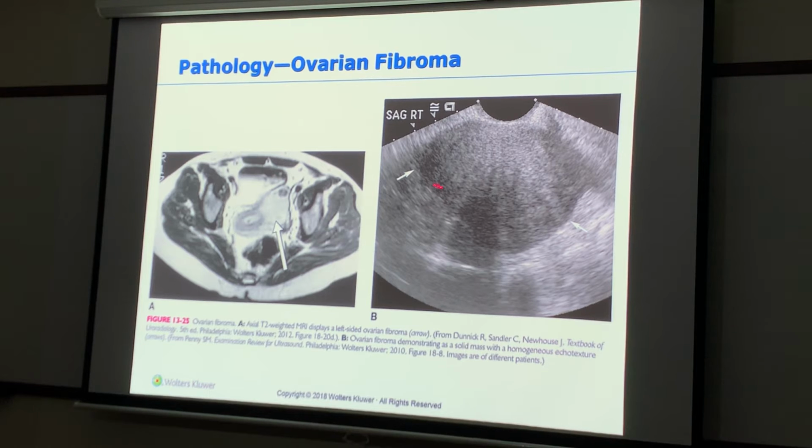Long and trans first. Because this is sagittal, so I'm gonna do midline with and without measurements. I'm gonna go medial. I'm gonna go out of it, come right back in and take an image. I'm gonna go back to mid. I'm gonna go lateral. I'm gonna go lateral again, out of it, right back into it, and take an image. So how many images is that?